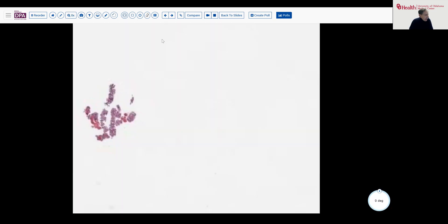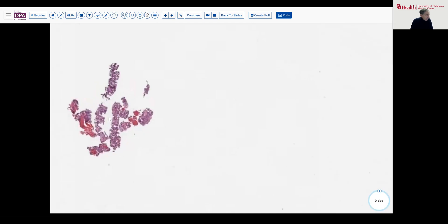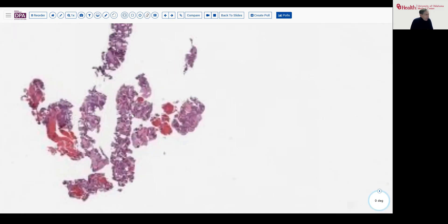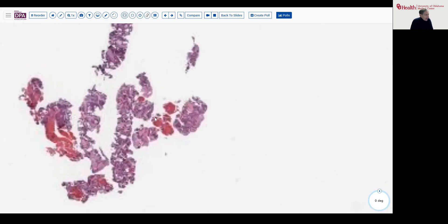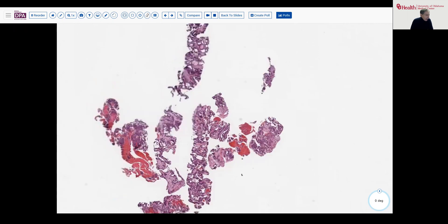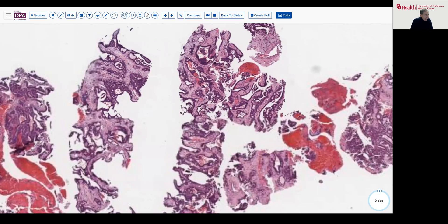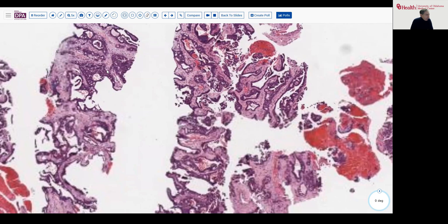Here we have representative cores, as you can see — fairly cellular tumor tissue with a lot of glandular spaces and epithelial lining, a little bit of cribriform pattern, perhaps.